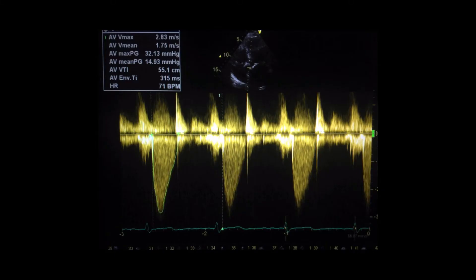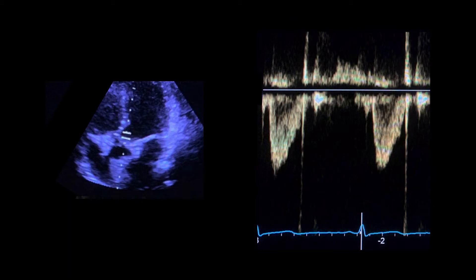The velocity-time integral of the aortic valve is obtained by drawing a trace around the waveform. Pulsed wave Doppler is used to record the velocity in the LVOT, normally from the apical 5-chamber window. The sample volume is adjusted to a position within the LVOT just before the aortic valve.